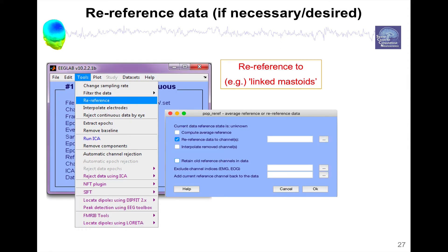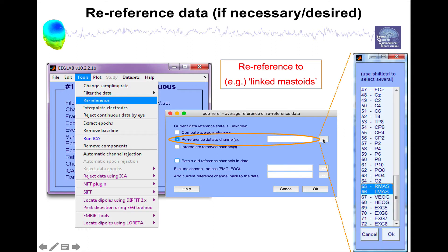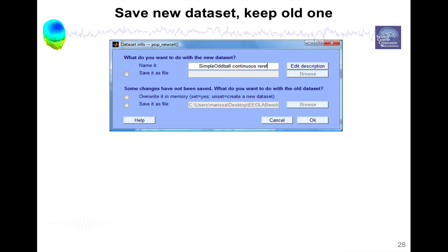We have the menu Tools > Re-reference, and when you select this menu you have an interface where you can select the channel you want to reference to. For instance, here we have 'Re-reference data to channel' — you check that checkbox and then select specific channels. For instance, we might want to reference to right mastoid and left mastoid, so-called linked mastoids. In that case we would select the two mastoid channels here and then press OK.